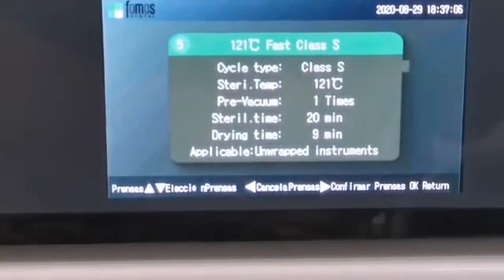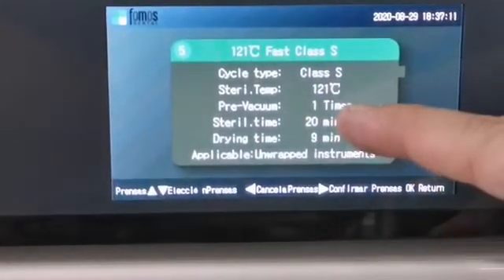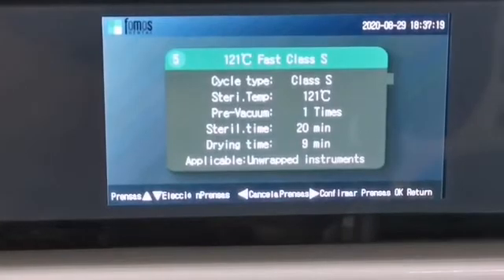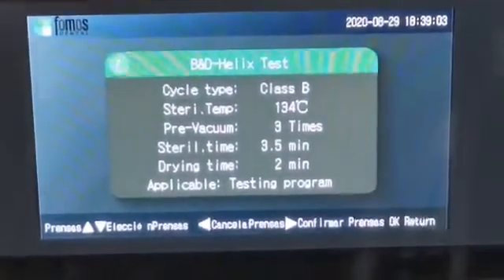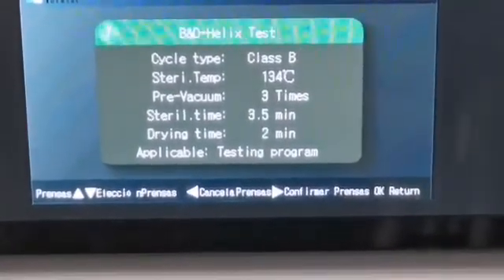Number 5: 121 degrees fast, class S — applicable for unwrapped instruments. Number 6: custom sterilization. Number 7: B&D helix test — for testing program. Number 8: leak and vacuum test — for testing program.